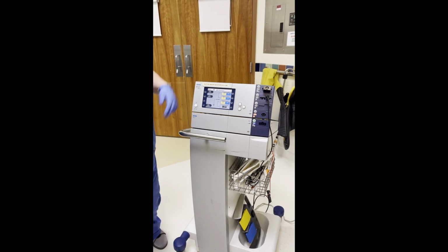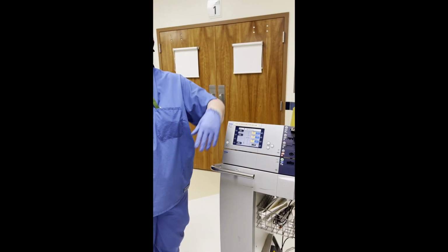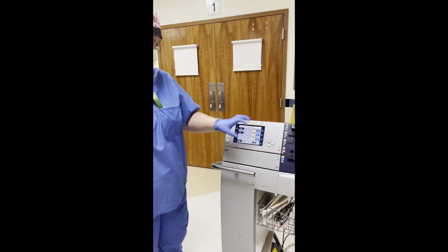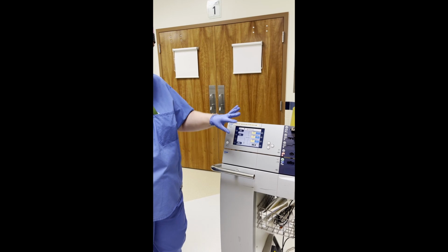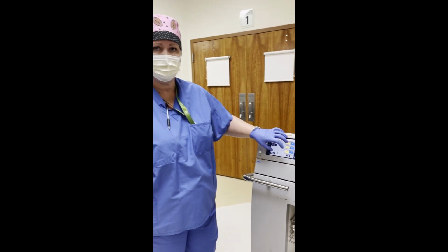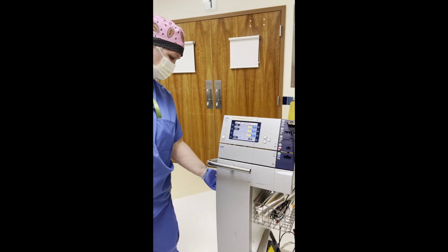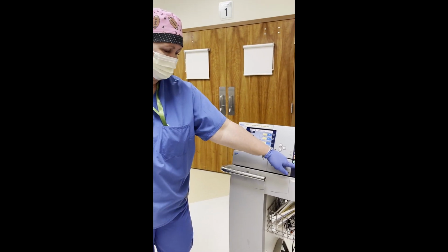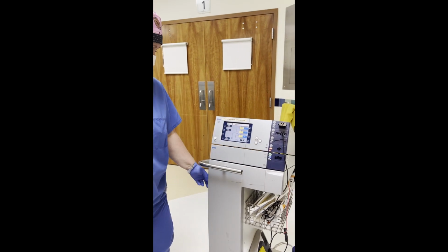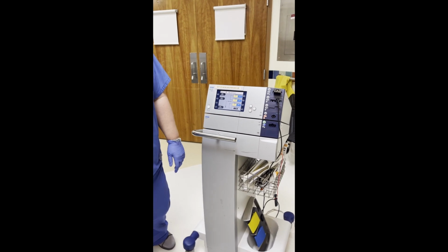If this is not open, then you cannot use the APC. It'll alarm, and there will be a red box. I'll actually show you, real quick, the error. So anyway, this is where the APC gas is, the argon plasma gas. For APC only, that is the only time you need to worry about the argon plasma gas, not with anything else.